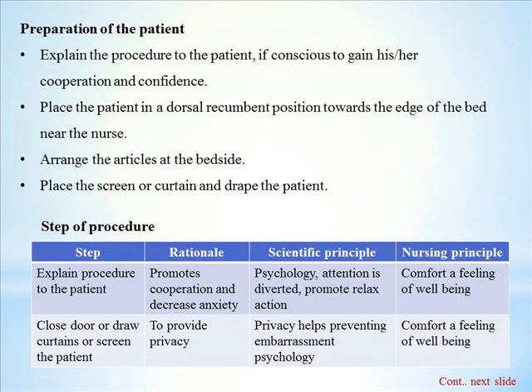Now we will see the steps of the procedure. We have to explain the procedure to the patient in order to promote cooperation and decrease the anxiety. The nursing principle here is comfort and a feeling of well-being. The scientific principle is that the patient's attention is diverted, which promotes relaxation.